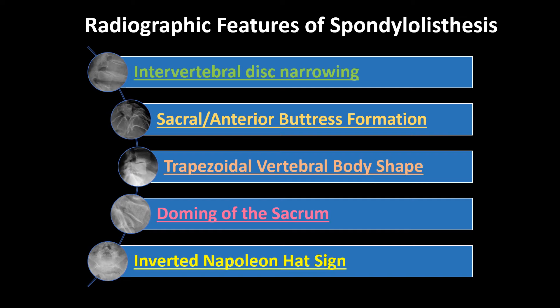Besides an anterolisthesis on an x-ray, there are multiple other radiographic features of a spondylolisthesis that may be present. These findings include intervertebral disc narrowing or degeneration if the spondylolisthesis has been there a while, anterior buttress formation, trapezoidal vertebral body shape, doming of the sacrum, and an inverted Napoleon hat sign. You don't have to see any of these, but if you do, you may be more confident in your diagnosis.